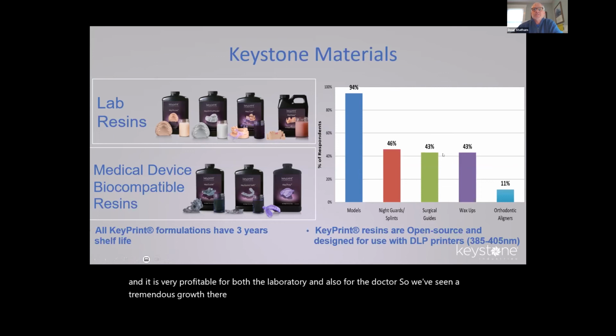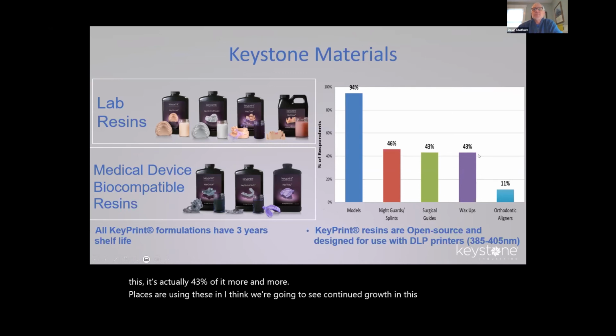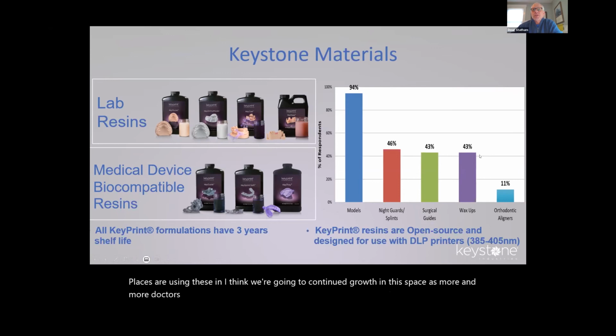Surgical guides, happily I'm seeing this, it's actually 43% of it. More and more cases are using these, and I think we're going to see continued growth in this space as more and more doctors become proficient at both using an intraoral scanner with an implant analog, or just the overall planning software that's out there for surgical guides.